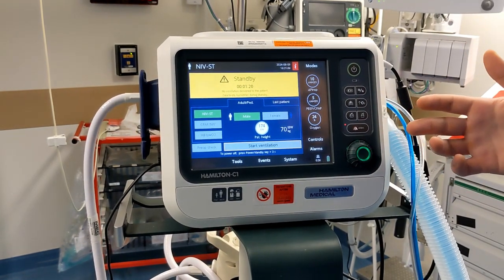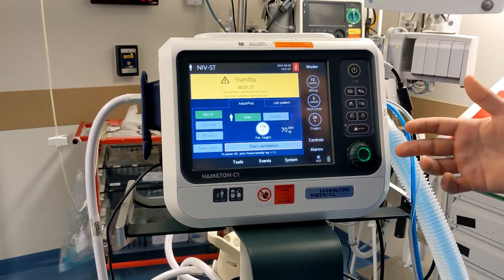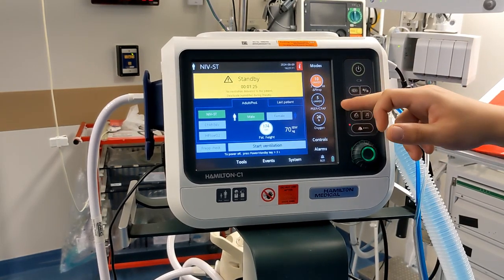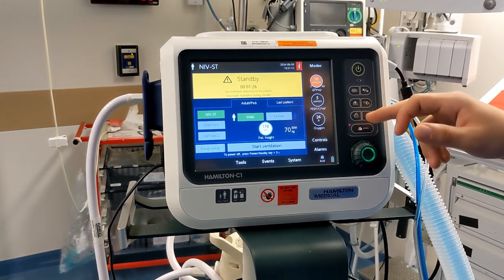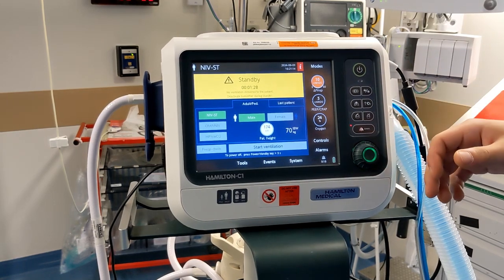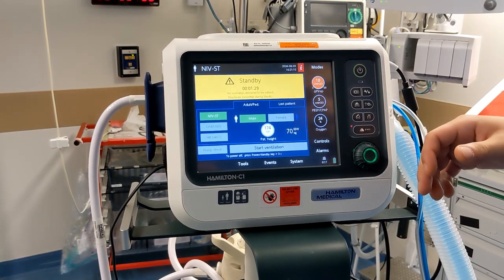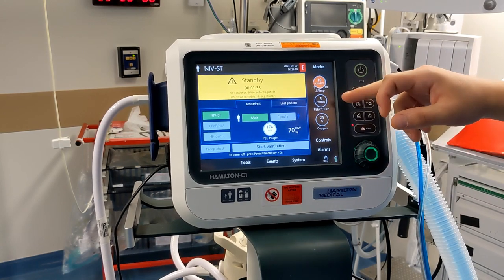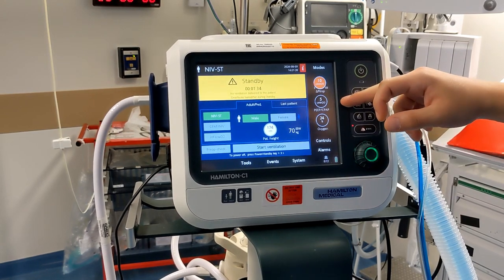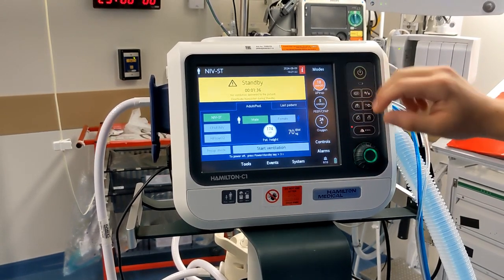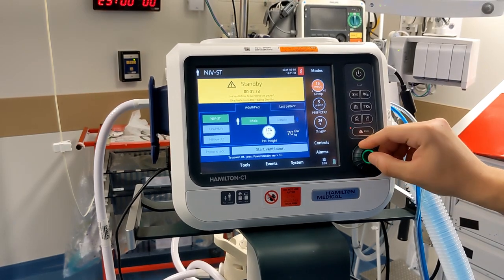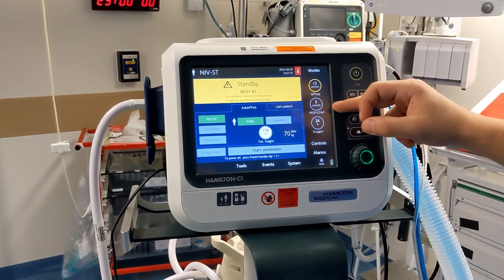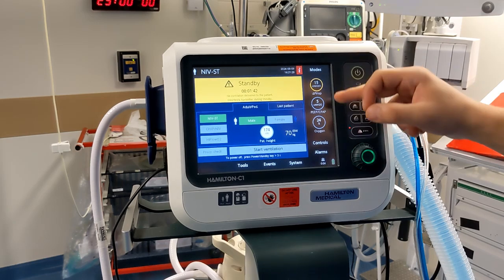If you want to change your inspiratory pressure, you will most likely change this number if you don't want to change the expiratory pressure. Say this patient is tolerating the BiPAP well and you want to take it to 20 over 5. Since 5 is your expiratory pressure you leave that as it is, and you take the delta P up to 15, because 15 plus 5 equals 20 over 5.